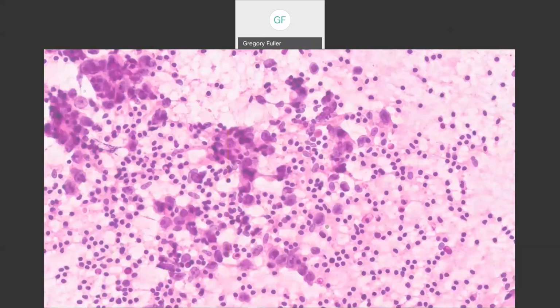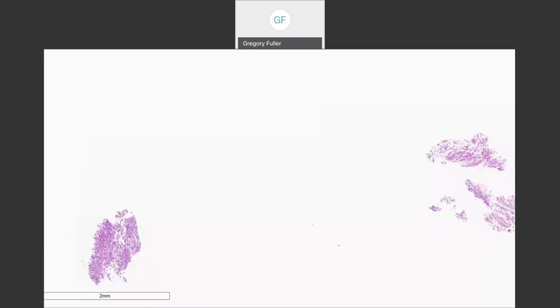You know what one of the problems with pathologists is? Seriously, it's endemic to the vast majority of us. Some of the young people coming up that have been imbued with genomic medicine, it may not be the case, but for most of us, we take too many pictures. We just take too many pictures. Here's one more. That is poster, that is textbook germinoma. Okay. Anyway, let's move on.